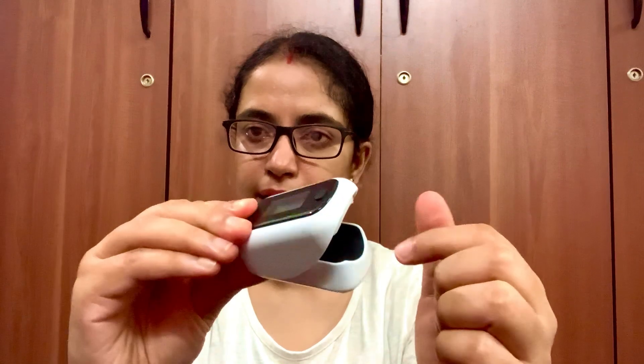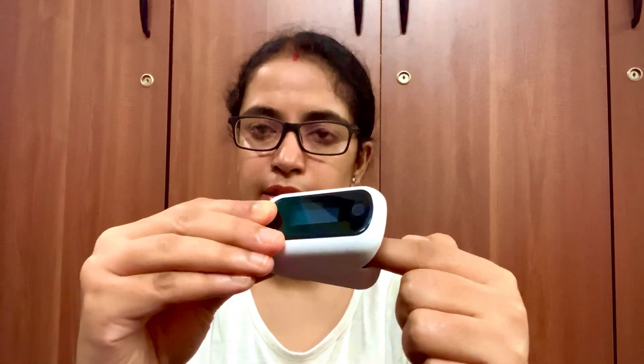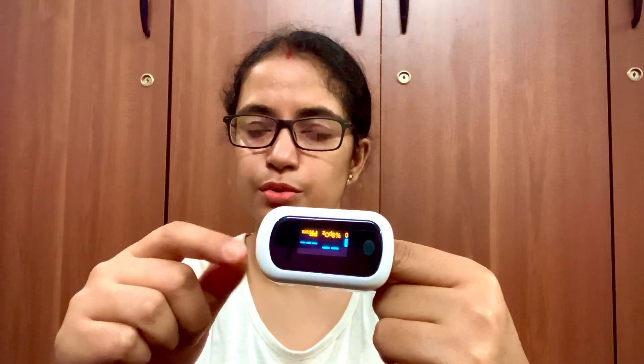This is a pulse oximeter. To use it, you just have to unclamp it like this. Then insert your index finger inside. Then switch it on. It will take a few seconds to detect.